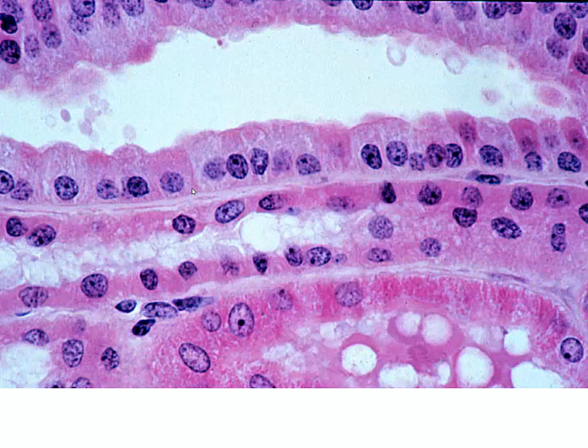Now as we start to look at our cortical medullary junction, we're starting to move away from that. Now we're going to be looking at our collecting ducts and collecting tubules. So remember, this is going to be part of our medullary ray as we're extending down into the medulla. And here we see some fairly tall cuboidal cells. And as we look at these tall cuboidal cells, very open diameter lumen, this is going to be our first indication that we're looking at a collecting duct.